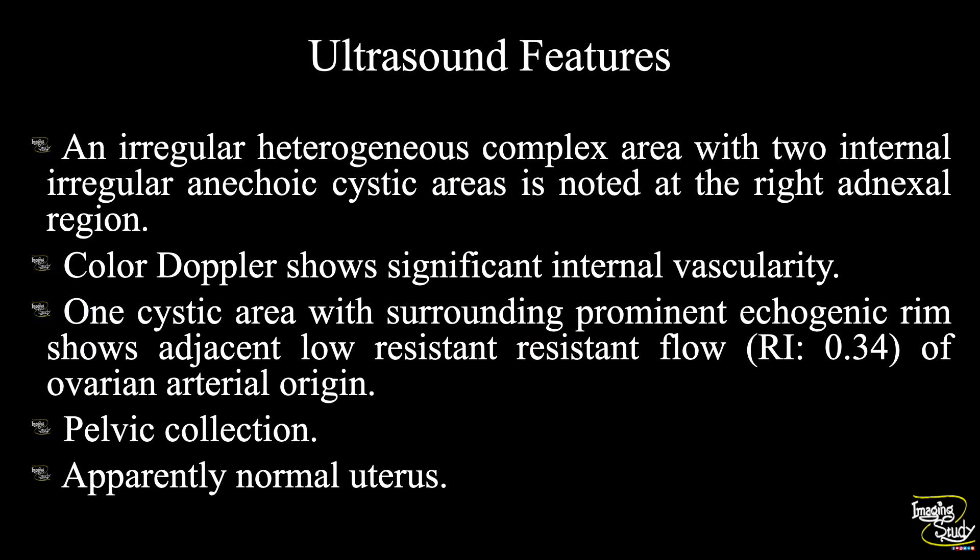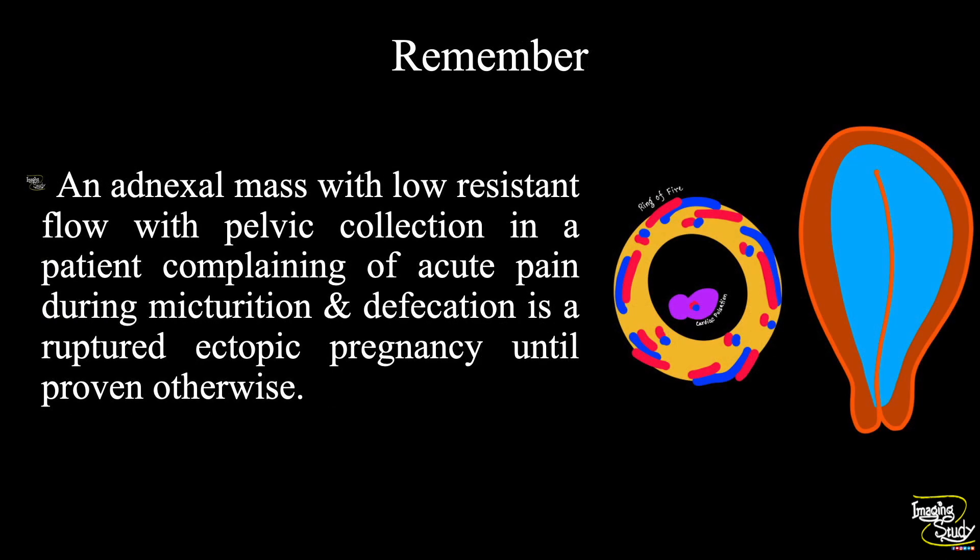In summary: an irregular heterogeneous complex area with two internal irregular anechoic cystic areas is noted at the right adnexal region. Color Doppler shows significant internal vascularity. One cystic area with a surrounding hyperechoic rim shows adjacent low-resistant flow of ovarian arterial origin, with a resistive index of 0.34. Pelvic collection indicates hemorrhagic content. The uterus apparently looks normal.